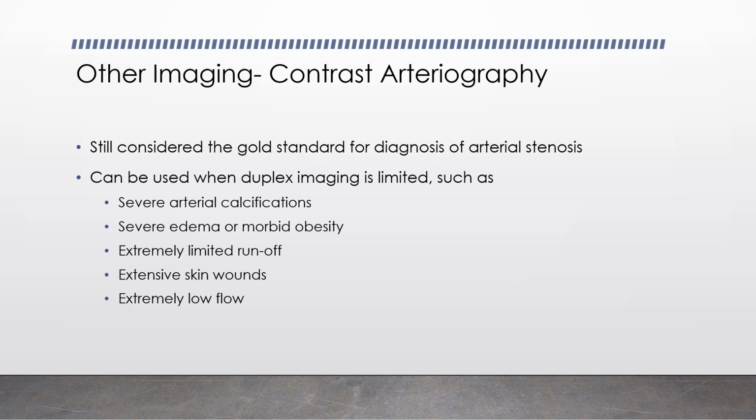If the patient has extensive skin wounds and you don't want to introduce the transducer to any sort of pathogens it may contain, then that would be another reason a patient might undergo arteriography as well. So arteriography is used in the heart. It's used really throughout the body.